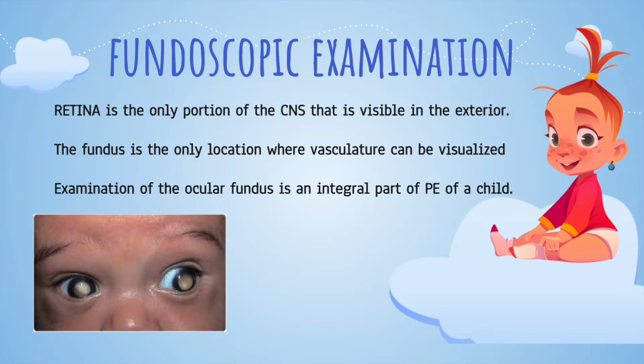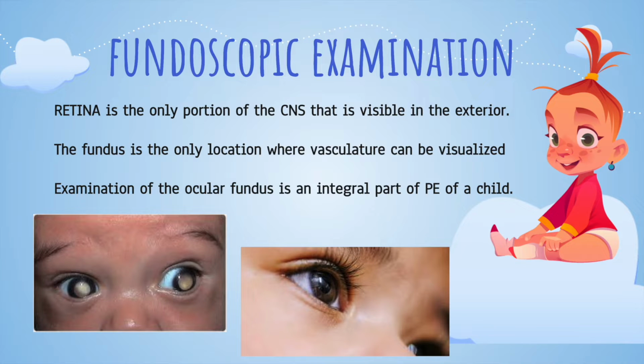By means of fundoscopic examination, we can diagnose whether the patient has glaucoma, shaken baby syndrome, or retinal detachment. Inspection of the ocular fundus may also help in the management of several systemic disorders like diabetes mellitus and SLE.